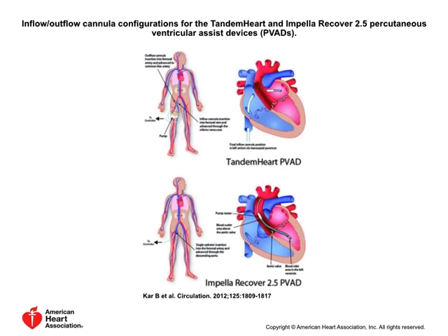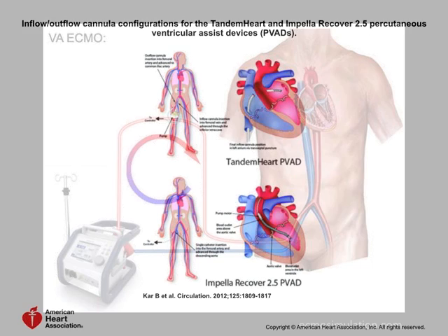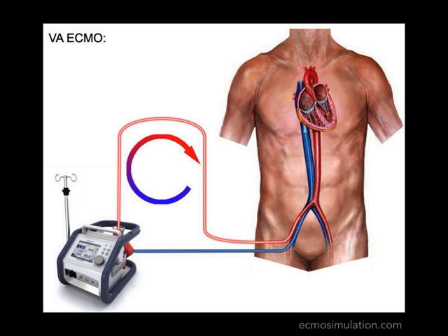This allows it to run with less anticoagulation, and it's a very good device, but it takes a relatively gutsy interventional cardiologist to be placing this thing because you can definitely have misadventures that can be fatal. The Impella is an easier device to place, but doesn't provide the level of support that you have with the Tandem Heart. ECMO provides exceptional support. It can provide full cardiocirculatory support, very high flows.